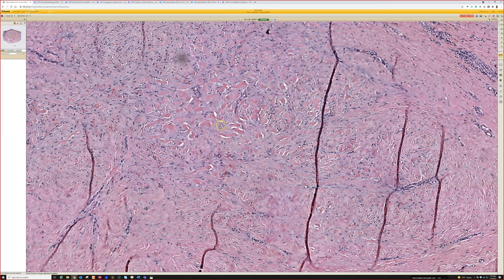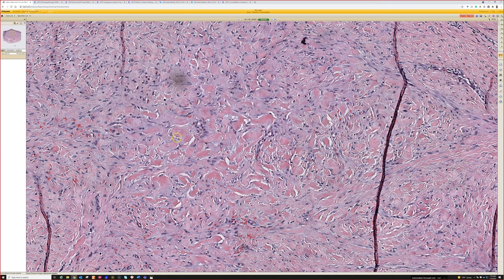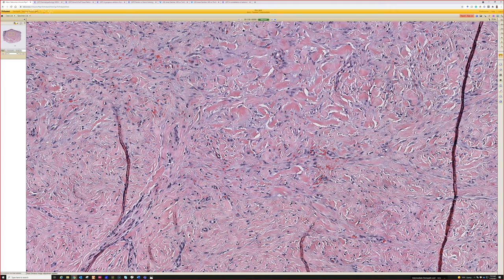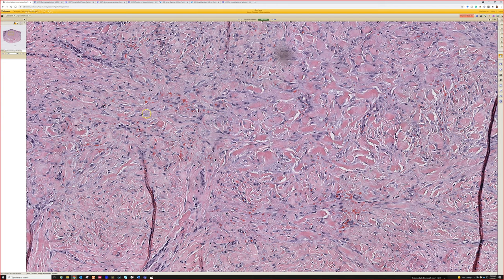You've got this big, thick reticular dermal collagen — bigger, thicker, and with a richer pink color. In the background there are reactive myofibroblasts and fibroblasts, sometimes with little red cells. Scars have overlap with reactive myofibroblasts and granulation tissue, which can look a little like fasciitis, sometimes nodular fasciitis. Just like in nodular fasciitis, you get extravasated red cells — you can see that in scars sometimes.